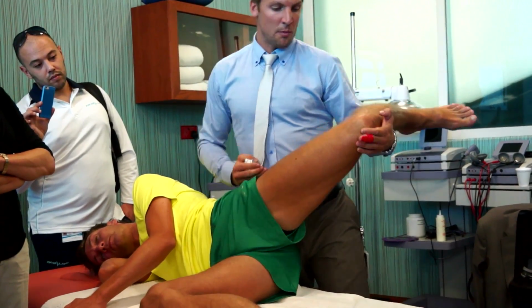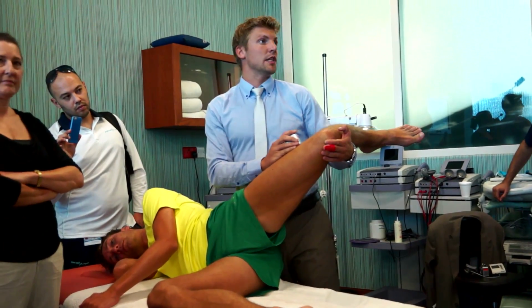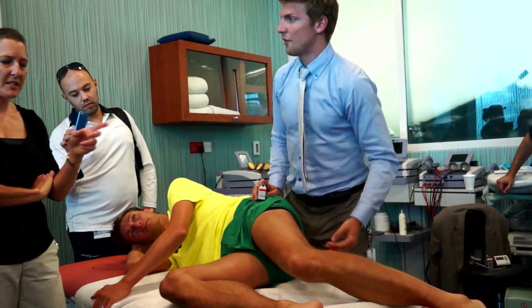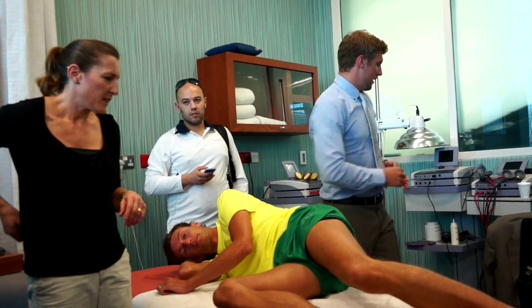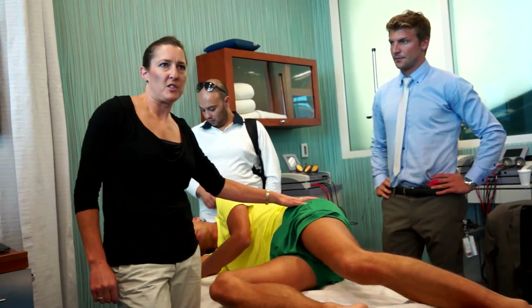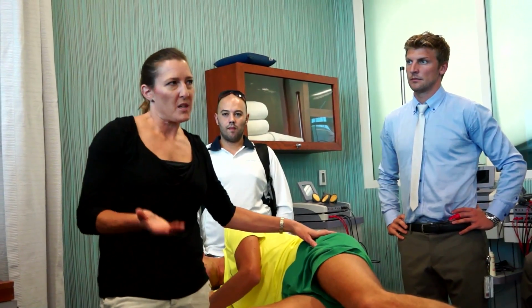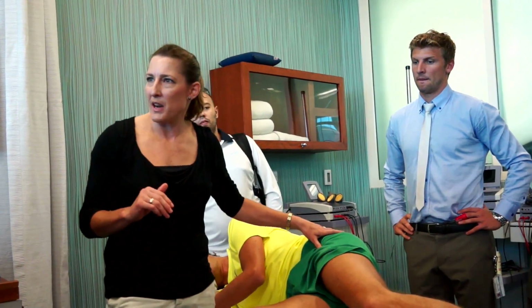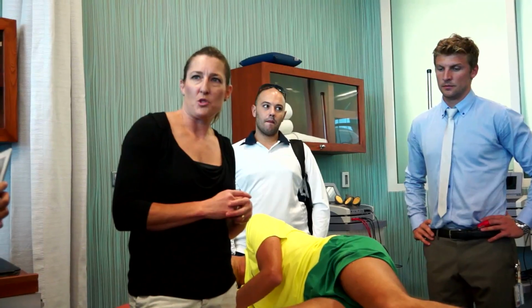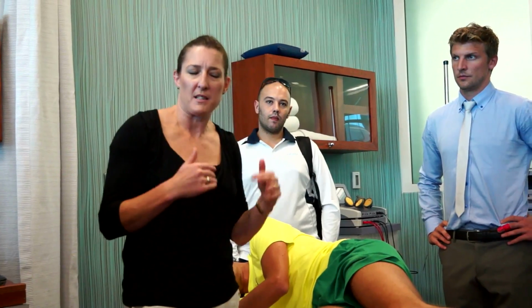So from our reliability study, we showed that the standard error measurement is within 3 degrees, so it's fairly accurate, or pretty good actually. So we had very good ICCs for this test as well. So one thing that we liked about this test, first of all, the fact that we could use the instrument and it showed to have great accuracy and reliability, but we're measuring hip abduction without taking into account the soft tissues around the knee. So we felt that perhaps this is more specific to the hip joint, and it's different from how hip abduction has been tested in the past.